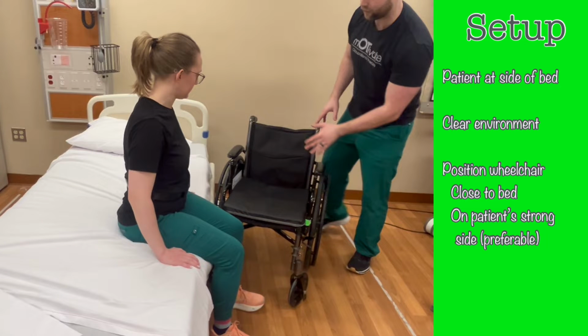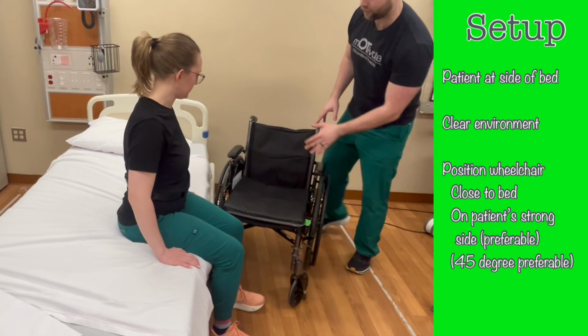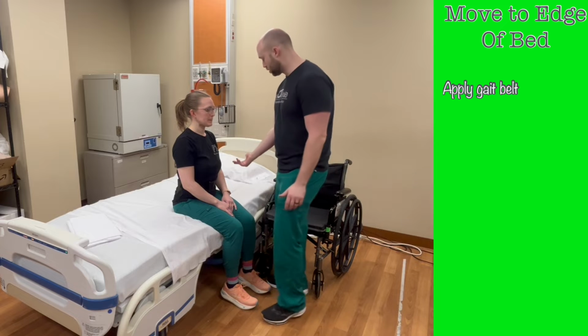The wheelchair should be as close to the bed as you can get it. Positioning at a 45-degree angle is helpful, but if not possible, putting it flush to the side of the bed will work. Once the wheelchair is in position, lock the wheels. Apply the gait belt to the patient, then have the patient scoot to the edge of the bed or chair.